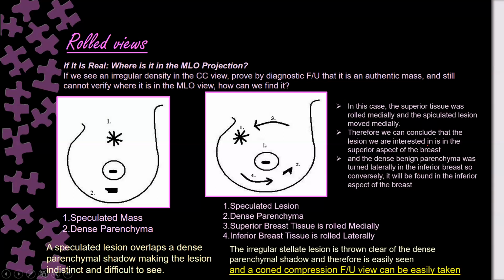So that means the real lesion can now be well seen, and I can do in this area a compression view to characterize it or to delineate it further. Is it clear?